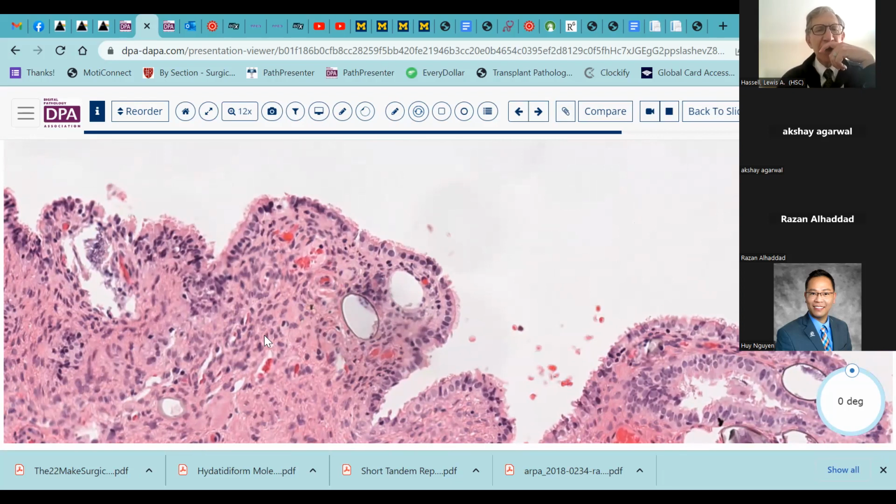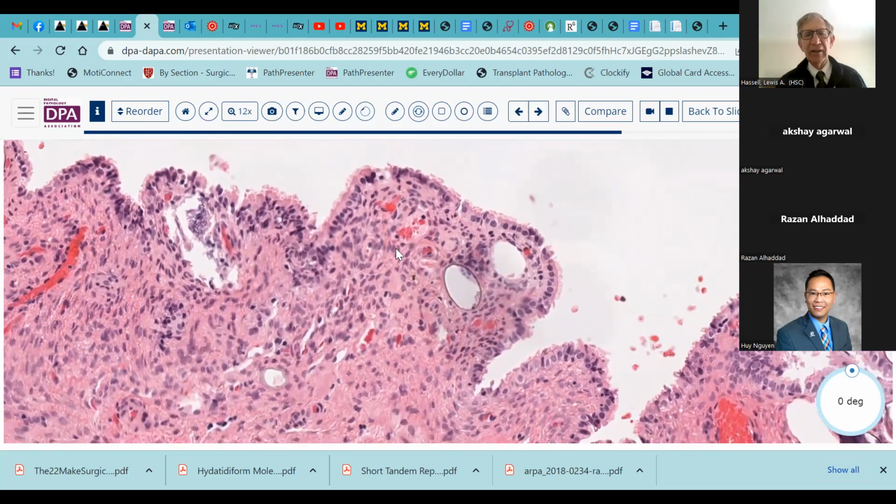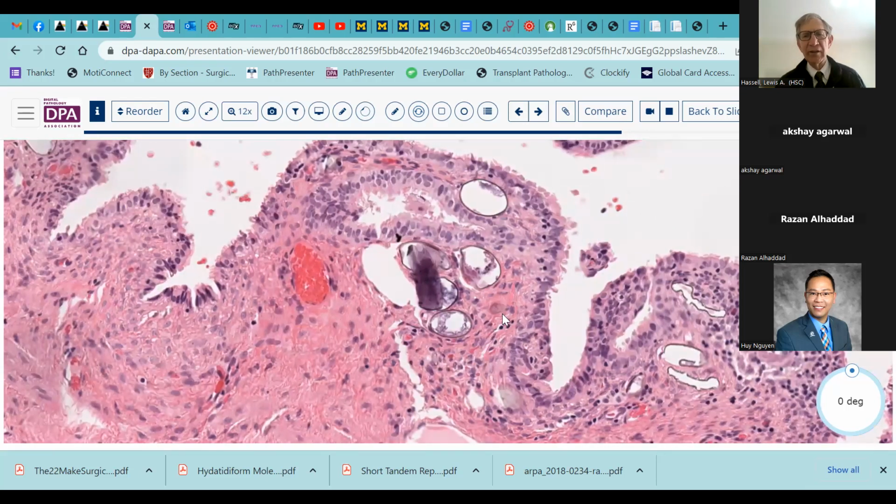Yeah, so I'm not familiar with that terminology. I mean, usually schistosoma mansoni does have that sort of lateral spine, but I didn't see any in here that I felt were sufficiently diagnostic to characterize as that. So aside from the ethnic or geographic origin of the patient, I don't think morphologically I could differentiate the species here. Certainly, schistosoma japonicum is round, or oval, without a spine. So if the patient were from a different geographical background, I might just say, well, that's probably what it is, rather than the other. So I don't know if that answers your question or not, but I think that just saying parasitic eggs or schistosoma species would probably be sufficient in terms of diagnostic reporting. Sure, thanks.